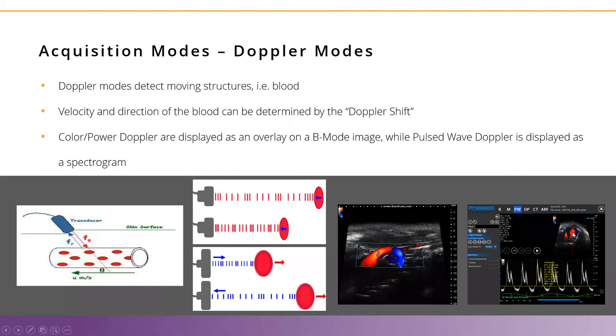And here we're specifically looking at the jet coming through the mitral valve, so going from the left atrium into the left ventricle. And this is a very characteristic waveform of that flow velocity. And we'll talk more about this when we look at specific images of cardiovascular function. But for those of you who do this work routinely in your lab, you'll recognize this right away with the full measurement package to assess diastolic function.